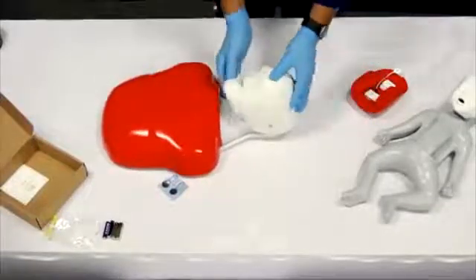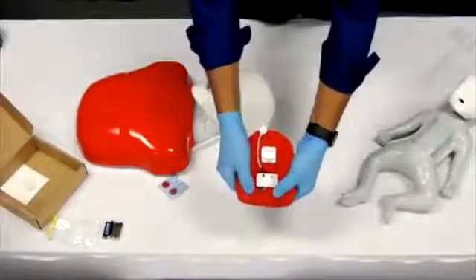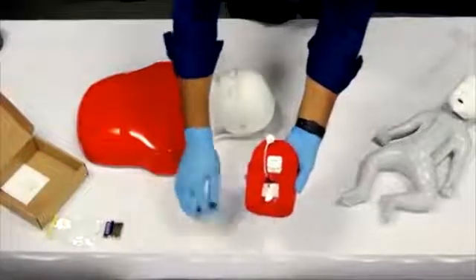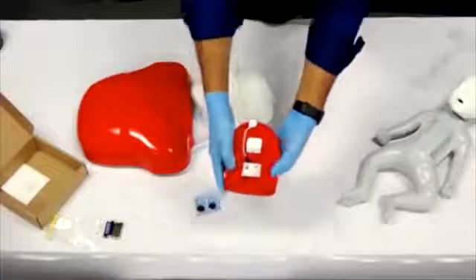The Baby Buddy Plus has electronic components adhered to the backside of the chest plate as shown. It too requires the same C-style battery, and that is also included. You just slide it into the battery compartment in the same fashion as shown before.